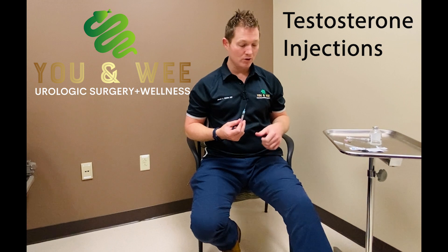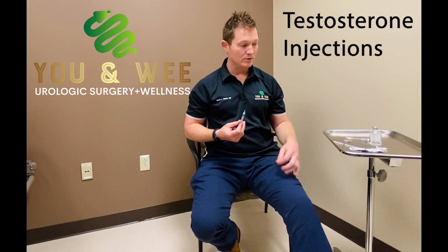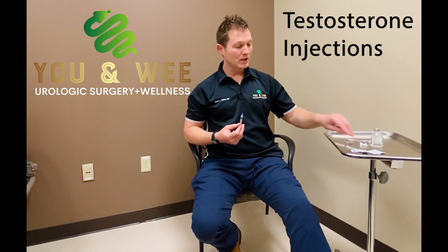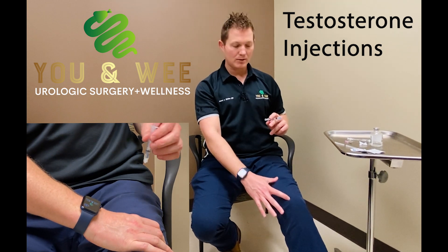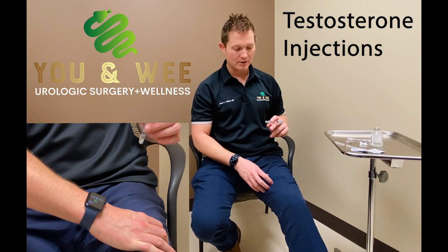You'll want to either have shorts on or slide your pants down. Use your alcohol prep pad to clean the area on your skin — this injection is going into the thigh, a good five centimeters or so away from the kneecap. You don't want to be close to the knee; you want to be in the muscle, the meat portion of your thigh.